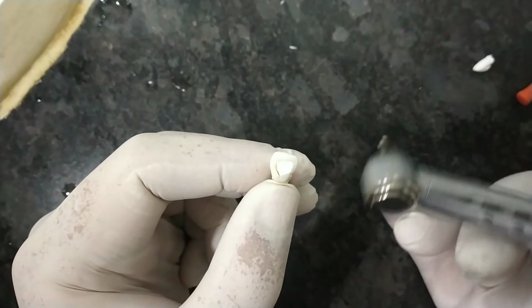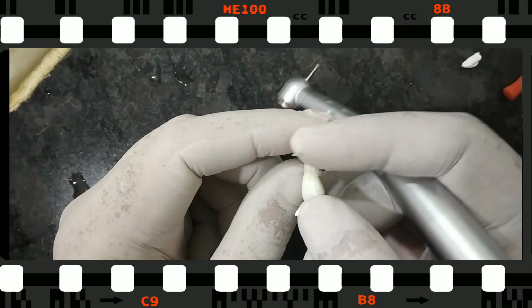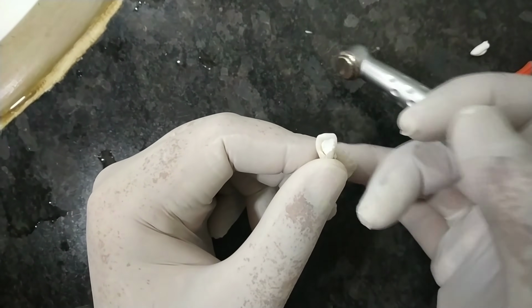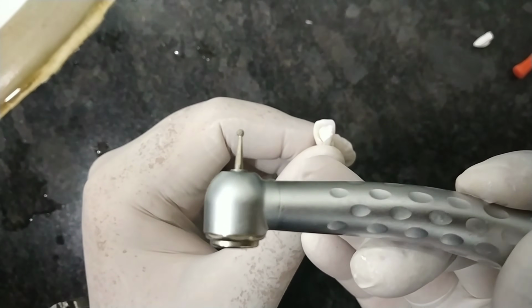The first tooth I am taking in order to show the root canal treatment is the upper anterior tooth. First of all, I have already done the access opening and closed it with temporary filling. So what burr do you have to take? You have to take a number 4 round burr, as you can see here.